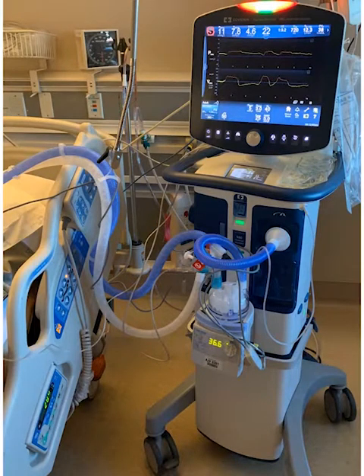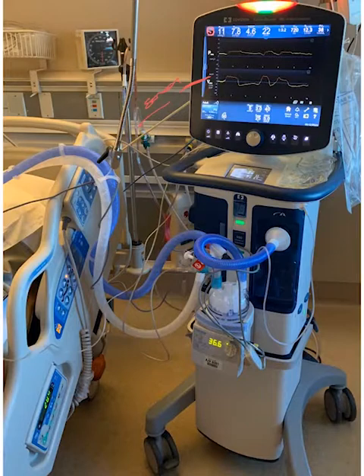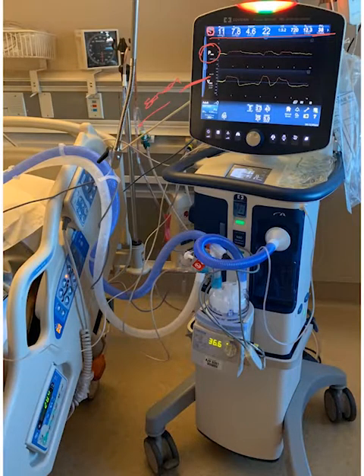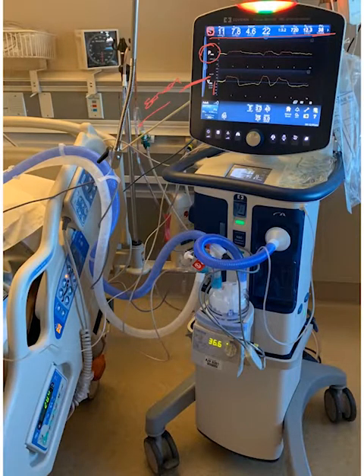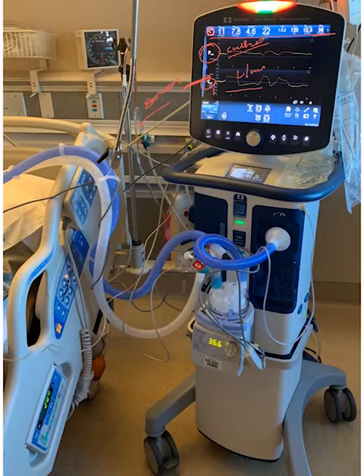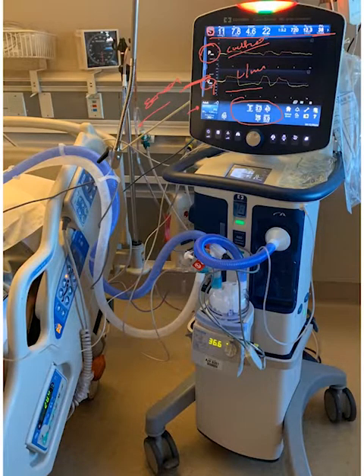This is the ventilator. You can see different kinds of ventilators, but the basic anatomy is the same. You always have a screen that gives you information — it could vary from ventilator to ventilator — but it provides patient information, waveforms, pressure in the circuit, flow in liters per minute, volume versus time, and pressure in centimeters H2O. You also have the ventilator settings and the mode displayed here.